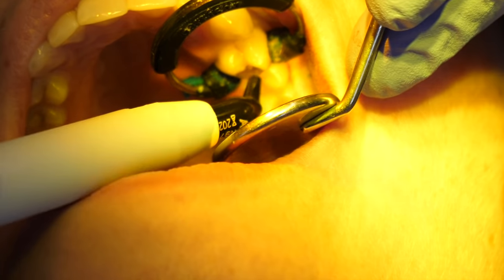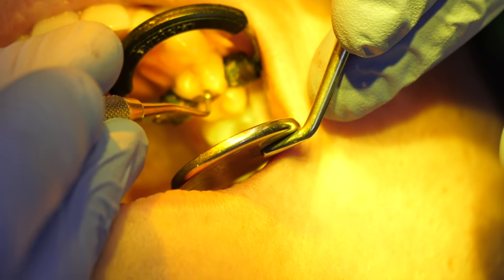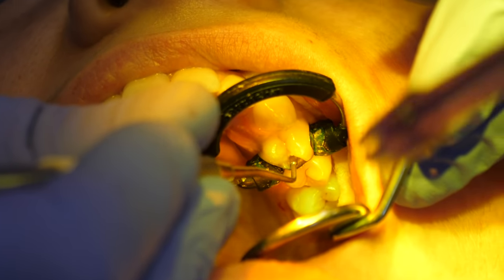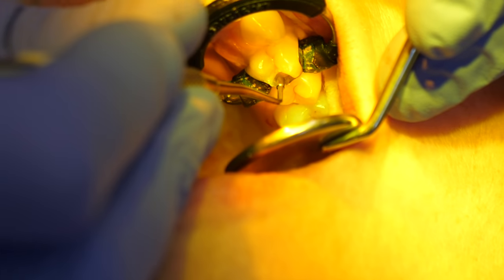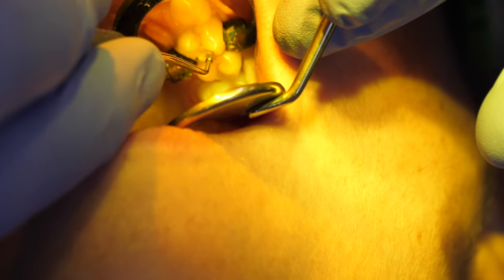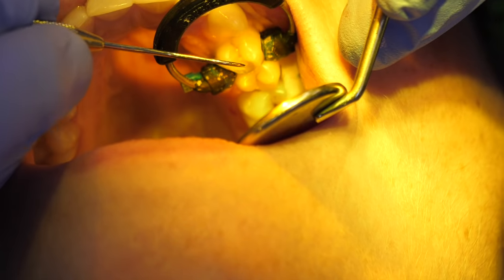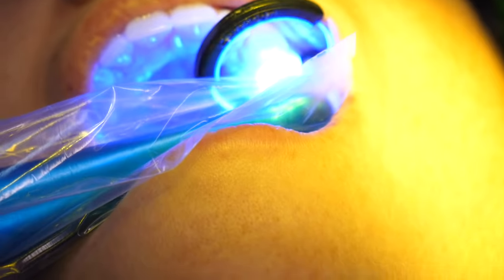Here they are placing the filling material onto the tooth, and now the different instruments are being used to pack it and make it look like a tooth. Dentists will spend some time on making it look like a tooth, right? They want to mold this composite filling material that they just placed on there so it can match the shape of the surrounding tooth. Once it is ready and the dentist is happy with the shape, again, this is usually the part that takes a little bit of time. After repeating this step a few times, adding the filling material, shaping it with the instruments, adding the filling material, shaping it with the instruments, then they will light cure it to harden it.